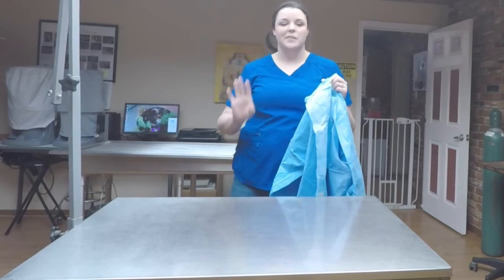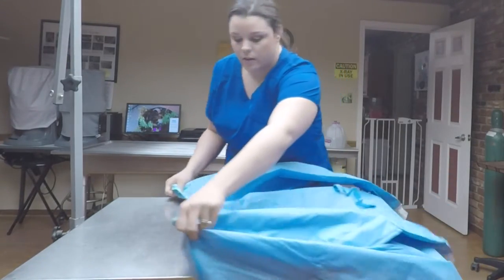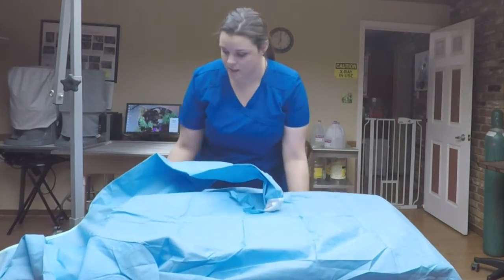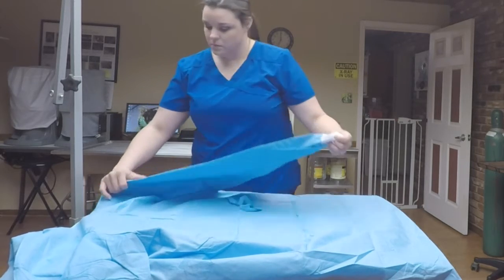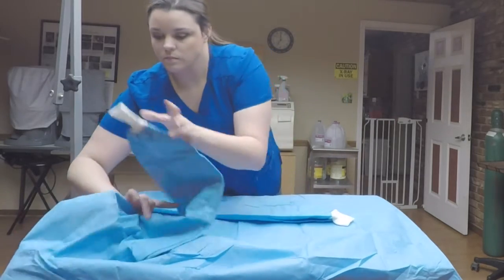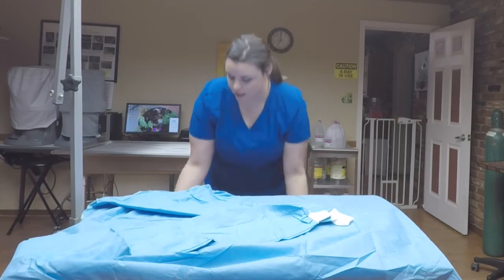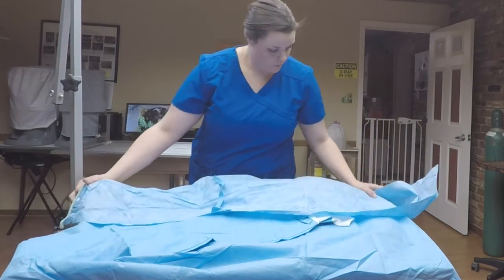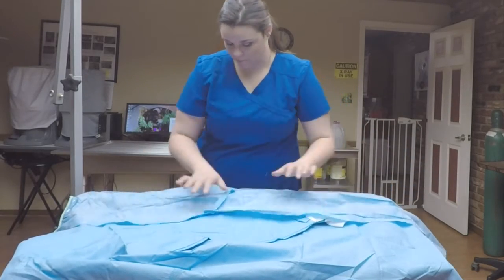This is how you properly wrap a surgical gown. So the easiest way, it's already ready to go. The easiest way is to lay it out on a table. You're going to want to bring the arms to the front of the gown. And then you're going to take each side of the gown and fold it towards the middle. About halfway is ideal.